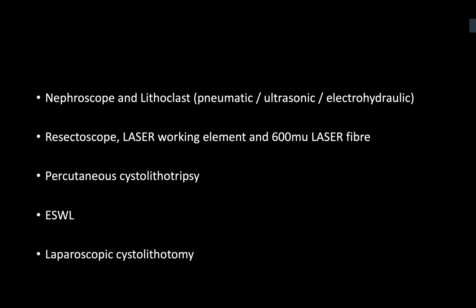Exactly. The EAU guidelines discuss shockwave lithotripsy, and there are papers saying that the success rate is around 80%, but it's not popular because we can get better and easier stone clearance by using the stone crushing forceps or even using the laser.